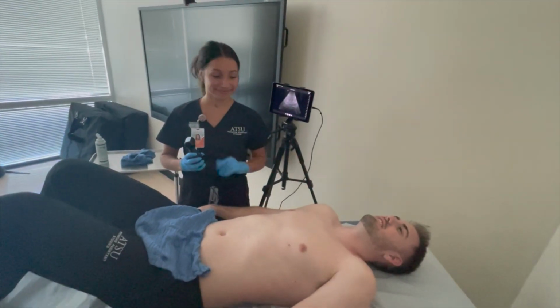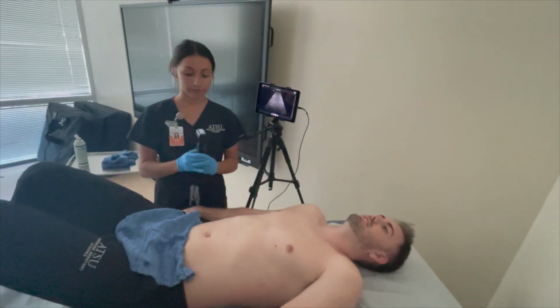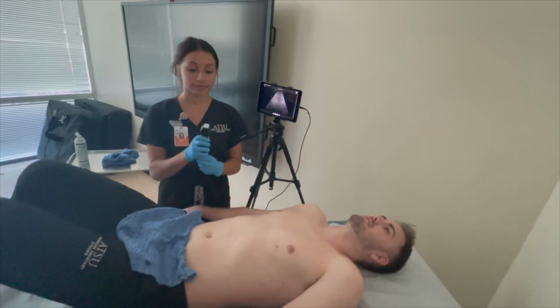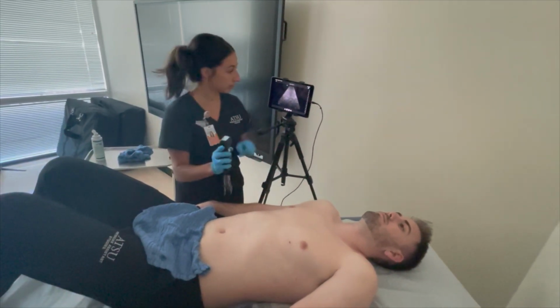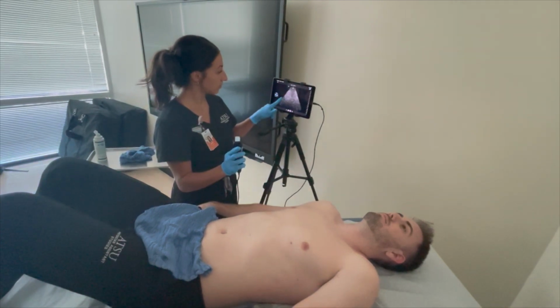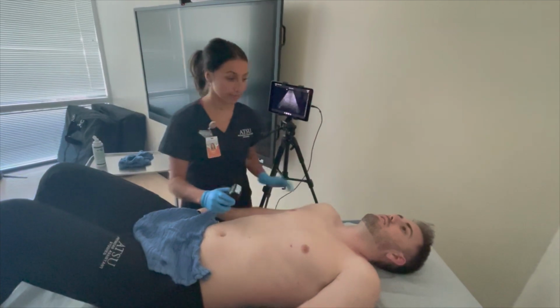The view here that we have is the cardiac view. The first thing that you'll do is hold the probe in the palm of your hand and use an overhand grip. Point the indicator towards the patient's right, which is the subxiphoid view, and adjust your depth setting to around 15 to 20 centimeters. Next, have the patient take a deep breath in.